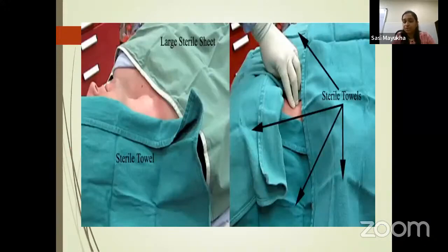So this is how a patient should be draped, because sterile precautions are very important for central line insertion. Catheter related infections are very high when aseptic precautions are not strictly followed.